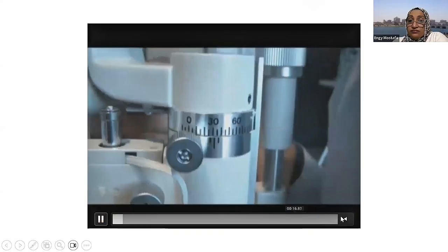Of course, in the same way, we can see the slit defects in the iris, through the iris atrophy, either in exfoliative syndrome, or if there's an iris atrophy secondary to glaucoma or to ischemia or whatever. Here, now, it is not the iris slits. The defects are not that obvious, but when we do the trans-illumination, see how obvious it is.